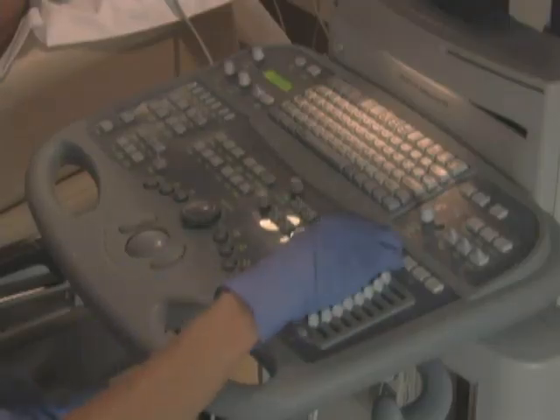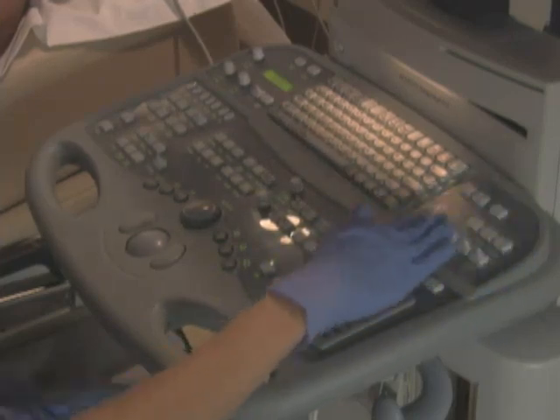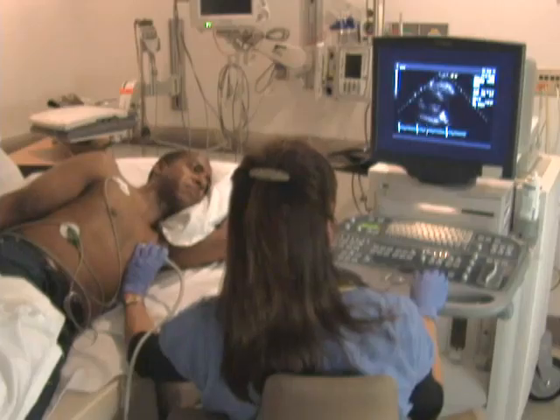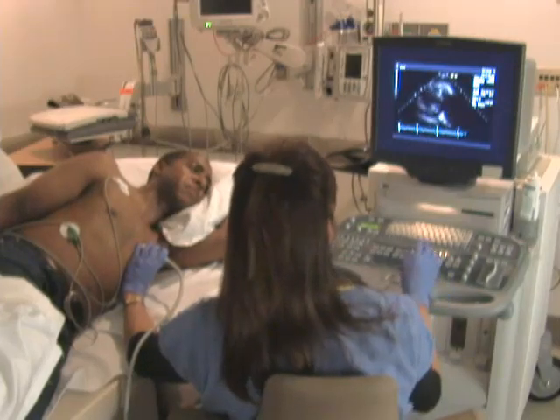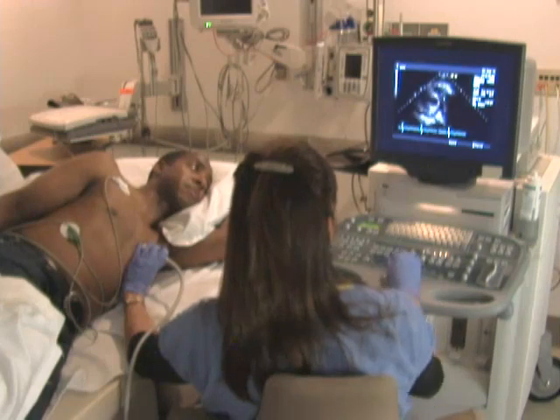Appropriate instrument settings are selected at the beginning of the study and then adjusted as needed for image and Doppler data acquisition throughout the examination. We typically record 2 beat cine loops, reverting to time-based acquisition with very irregular or rapid rhythms.